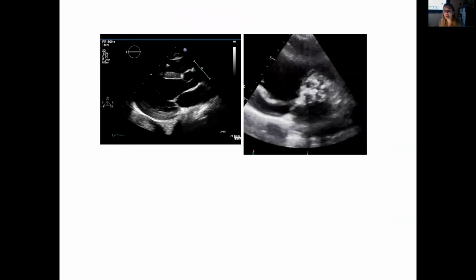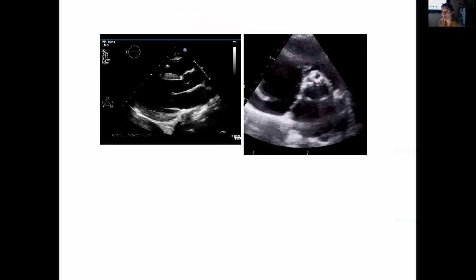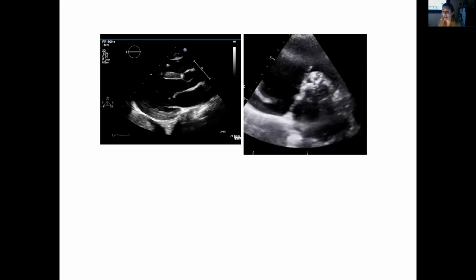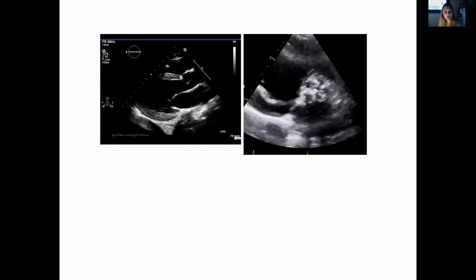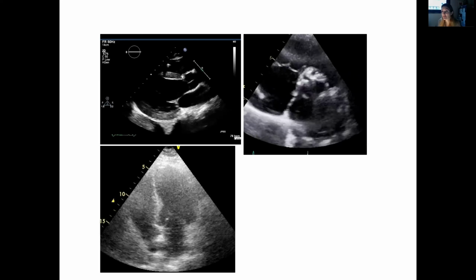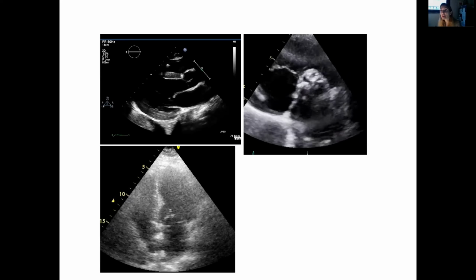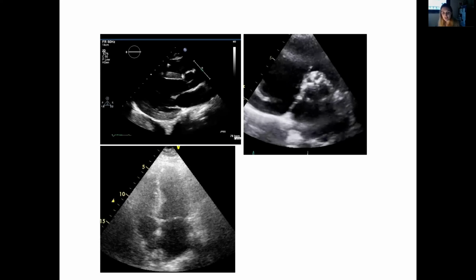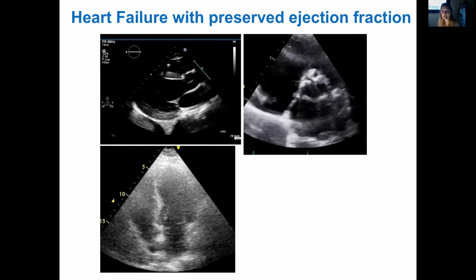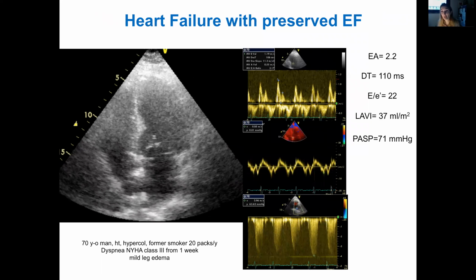The same we can say if you see this aortic valve, which is fully calcified, so this patient likely has a severe aortic stenosis, and again, you can expect to have B-lines, you can expect to have extravascular lung water. But when you see this heart, you actually have a normal preserved ejection fraction, maybe the left atrium is a bit enlarged, but there is nothing really striking about this heart, okay? So if this patient comes with dyspnea, and maybe has a heart failure with preserved ejection fraction, it's very nice if you see the B-lines because you feel much more confident.